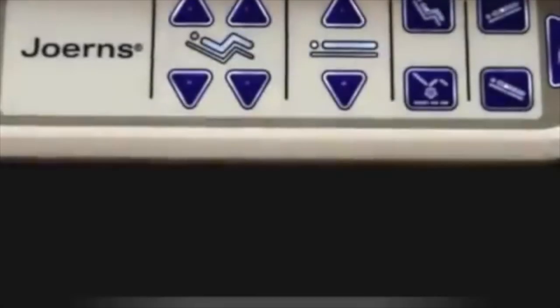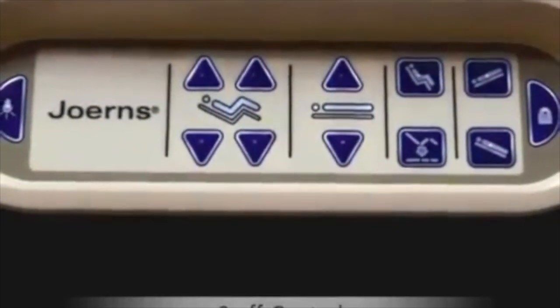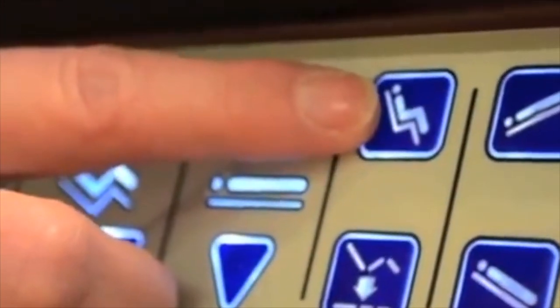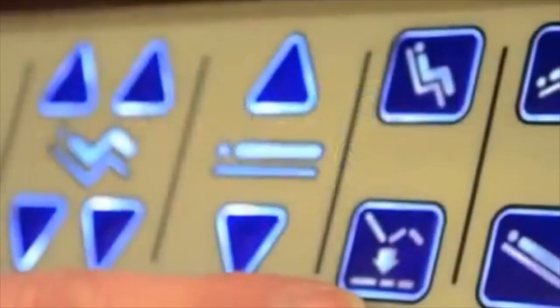In addition to the hand pendant, the bed can also be controlled by using the staff control, which is located on the footboard of the bed. Note, the staff control is not on every bed. Throughout this video, we will show examples of using both the hand pendant and staff control.